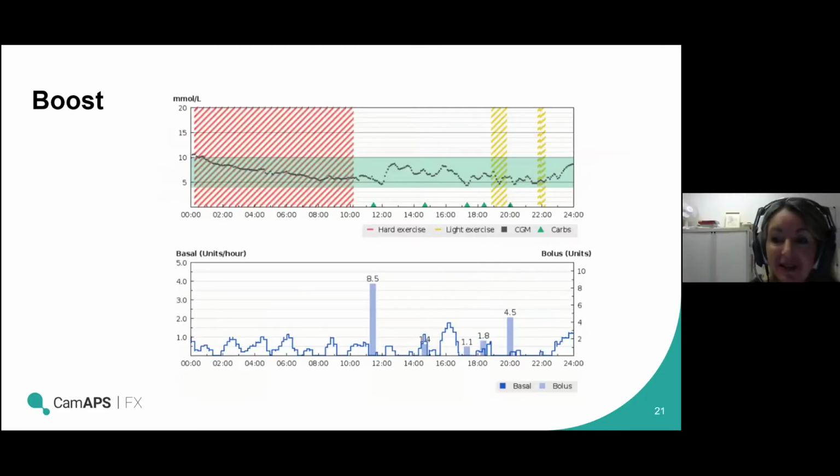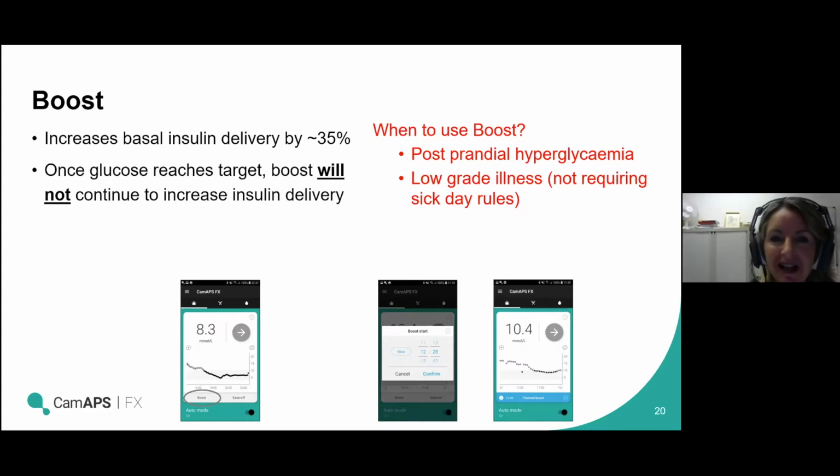And Charlotte, I'd say it's almost ubiquitous. Certainly after about 12 to 14 weeks, most women need to be using Boost, especially after the evening meal, it seems. And often they think they'll just put it on for an hour or two. So it's really important to reiterate that message. You can leave it on for longer, stick it on for like 2 to 4 hours, knowing that it will safely turn itself off. Brilliant.